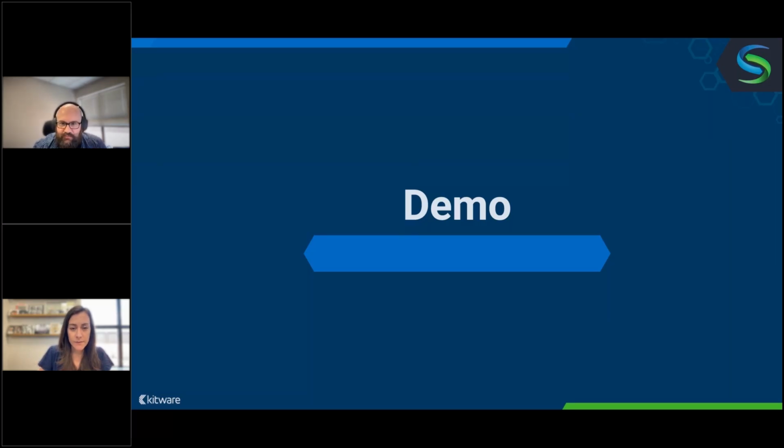We also have a question on logistics. Is it possible to install any of the features discussed today as standalone Python modules, or is it possible to run SlicerSALT in batch mode through the terminal? The answer is yes. SlicerSALT is based on 3D Slicer, and 3D Slicer has an option to launch modules without triggering the GUI.